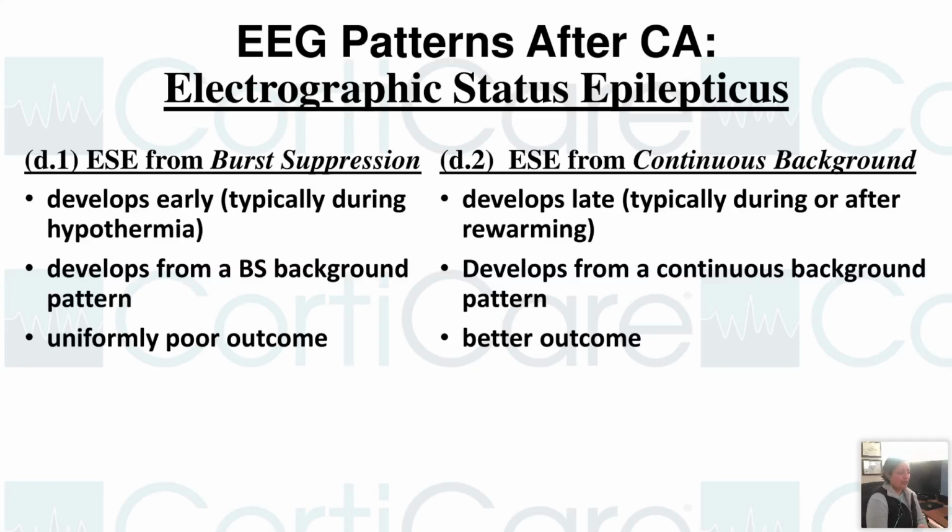So you have to be very clear. I know we are not responsible for the outcomes. We are not responsible for the treatments, but just so you know how the evolution of EEG happens post-cardiac arrest, how the changes are taking place in the patient's background says a lot about the prognosis.